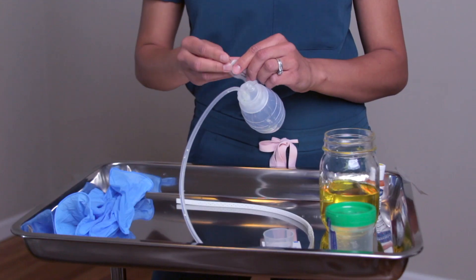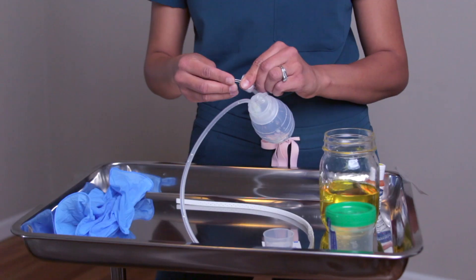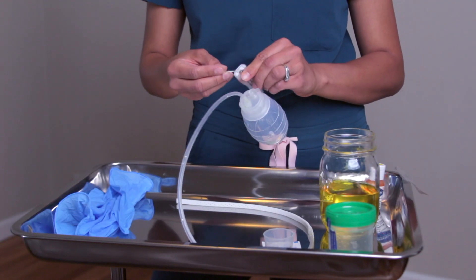The hang ring is attached to a safety pin, which will be secured to your patient's gown to prevent it from getting kinked or pulled — because you definitely don't want it to be dislodged.